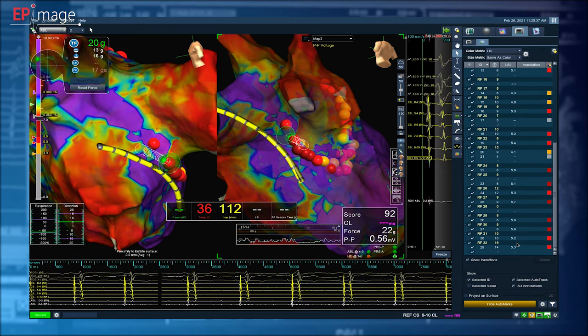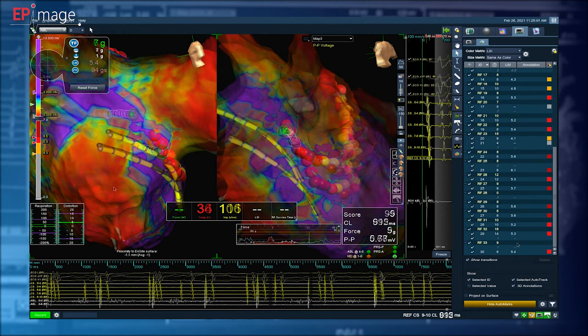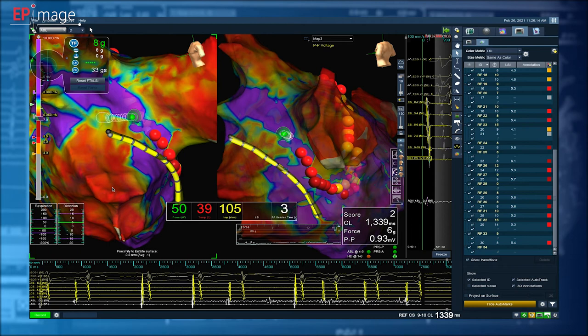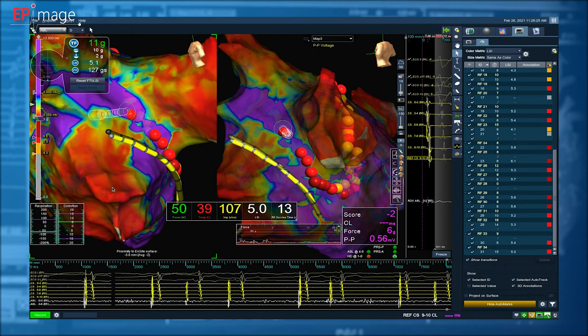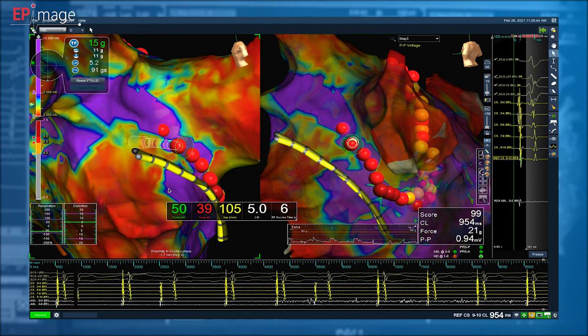We are performing ablation in sedated but completely alert patients. We don't use an esophageal probe, but for us this complete contact with the patient is also some kind of a signal. Any pain reported by a patient gives us extra information that we could be quite close to the esophagus. What we have noticed is that with a high power ablation, it's very rare for the patient to report pain.